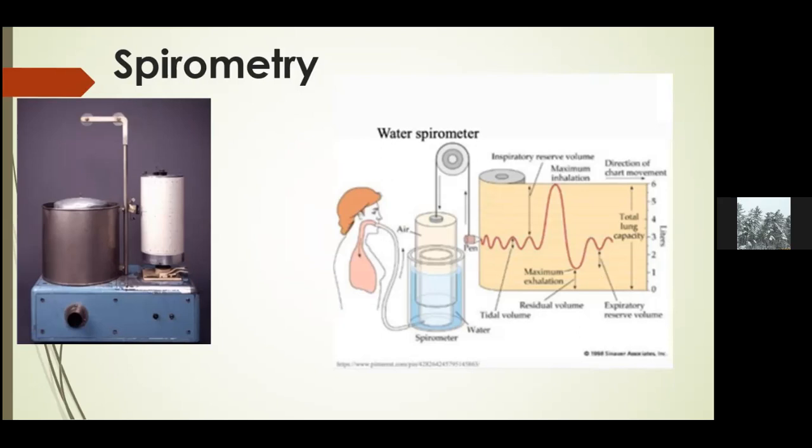So it is very easy to look at this physically and relate it to the graphs that you're getting. However, when you go to the lab next week, this is not the setup you'll be having. The reason I usually introduce my spirometry with this setup is because you can relate the inhaling and exhaling to the graph that you get here.